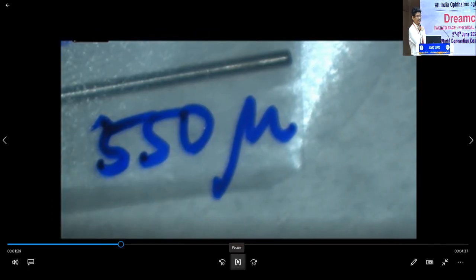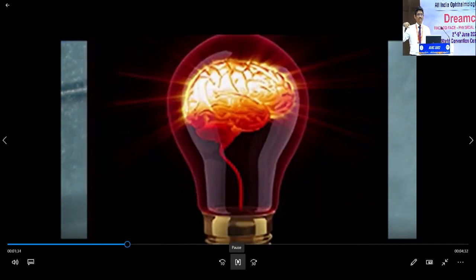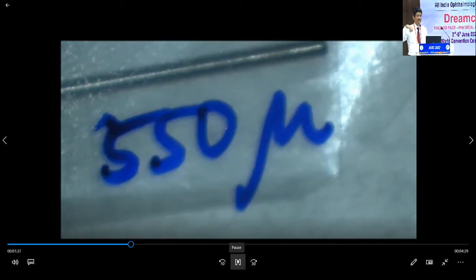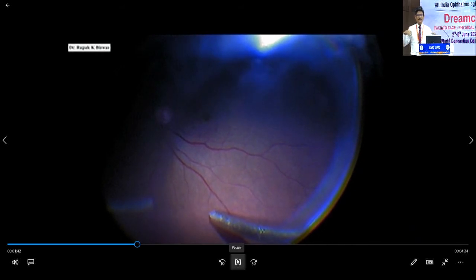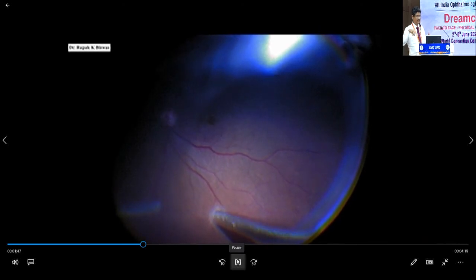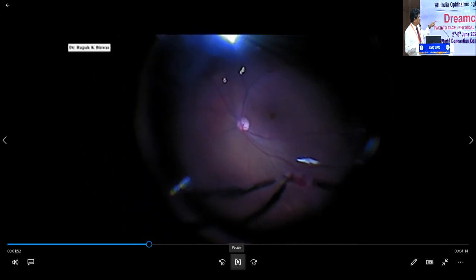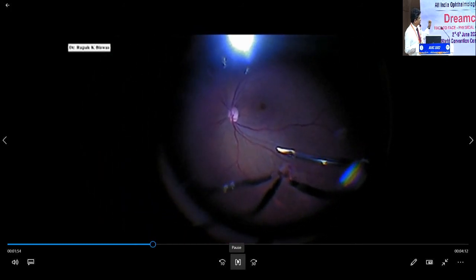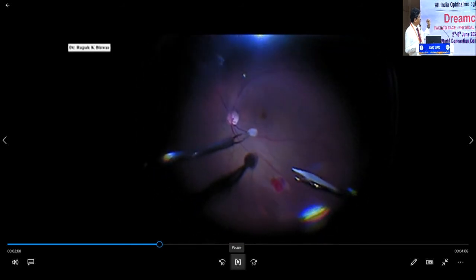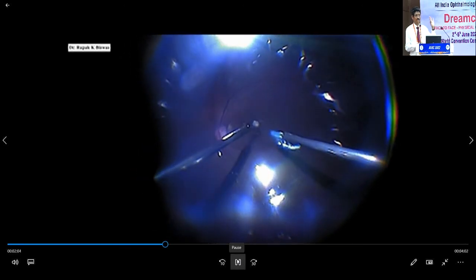We designed a special kind of trephine so that you can take an autologous retinal graft from another part of the same eye. I have chosen — depending on right eye or left eye — usually the superior part, for the sake of making surgery easier. You just trephine that area. This is a predetermined size of the trephine which I have taken. The graft is freed from the underlying choroid, and you can see it very clearly that the graft is taken in hand.